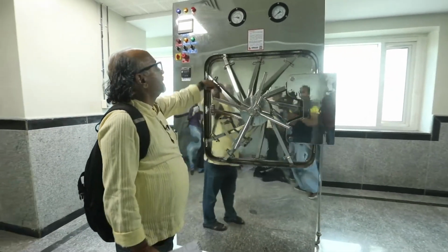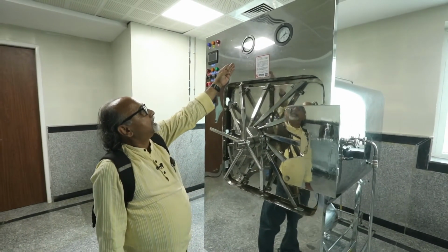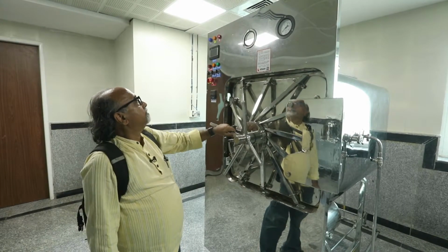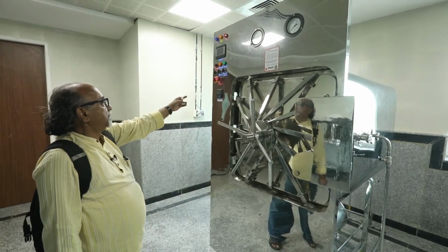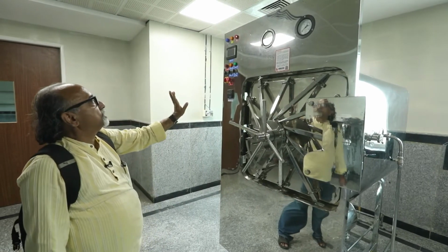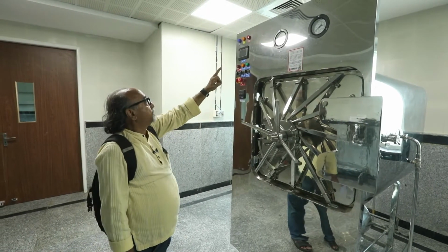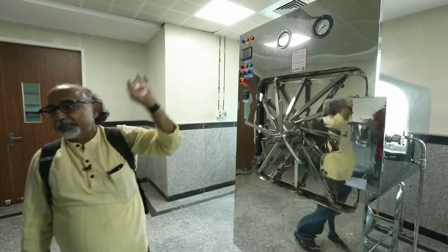So, you have here the gauge which gives you the chamber pressure and the temperature in there. Temperature is in degrees, and kg per centimeter square is the pressure we have here. So, water level, heater level, chamber release, emergency stop. It prints each and every sample of yours. R, Y, B are the three phases of electricals which you get in there. So, that is the electrical, the plumbing and the pressure in there.